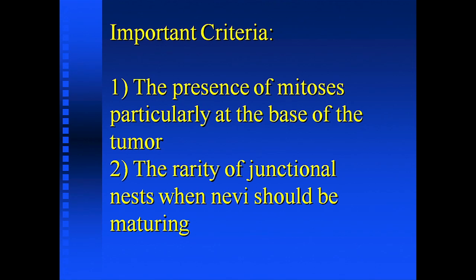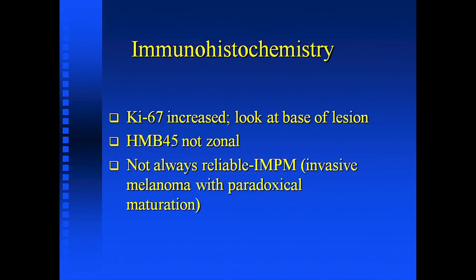So this is very hard to diagnose, and I can't tell you how many times it's been missed. And you always hear about cases when a melanocytic lesion is missed. You just hear about it. It comes to the tertiary medical centers. You look for the presence of mitoses, particularly at the base, and in lesions that should be purely intradermal, if you see evidence of cells in the epidermis, when the nevi should be completely mature by that time, then you should suspect that diagnosis. Also, immunohistochemical studies do help.